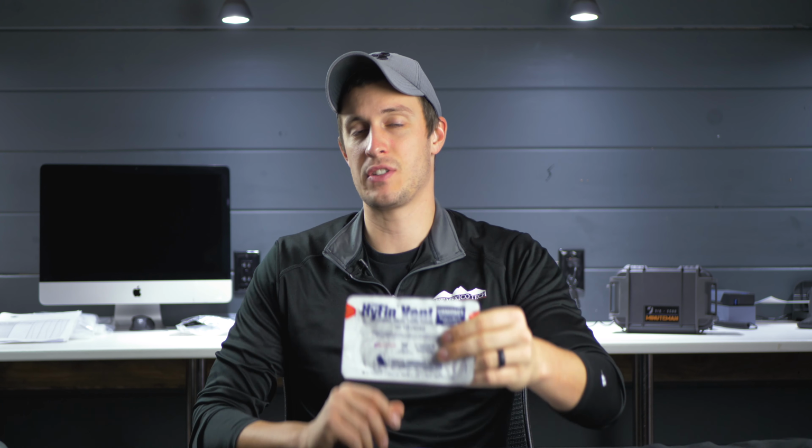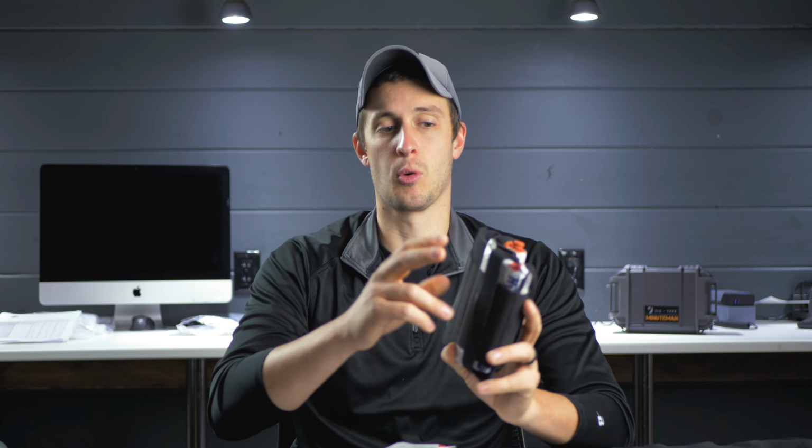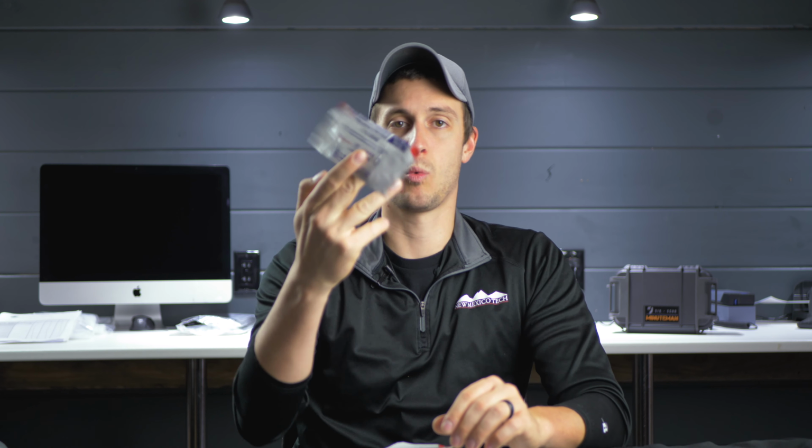Now, unfortunately, I don't have any of these that are 5 years or past for us to be able to test, but I have some that I have worn regularly in my ankle kit for the last 2 years. I've got some that have been in vehicle kits wadded up for the last 2 years as well. So those ones in the vehicle have sat in hot Tennessee summers. They've also sat in the vehicle when it's been cold outside.